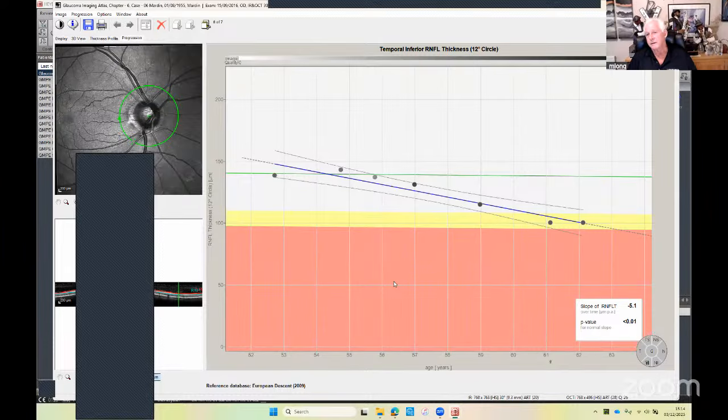I think if you consider the variability of OCTs in general, it's reckoned to be 5 microns. I would say if you're starting to see 2 standard deviations, let's say something between 7, 8, 9 microns, going up towards 10, because the average thickness of nerve fiber that you see in the clinic is between 80 and 100 in normals when they come to the clinic, if they're suspects of glaucoma.